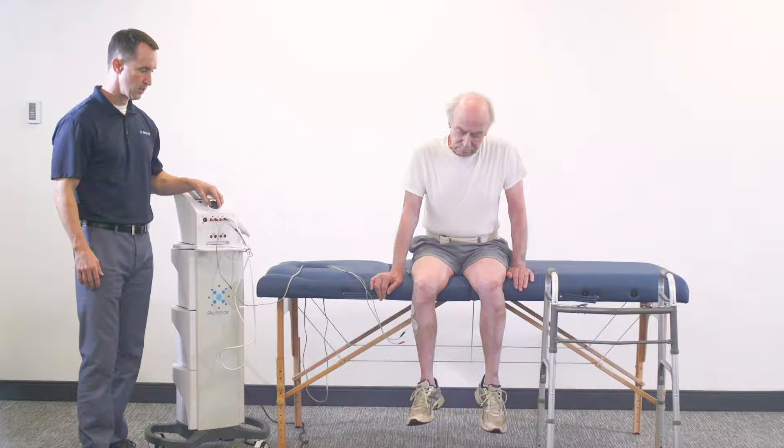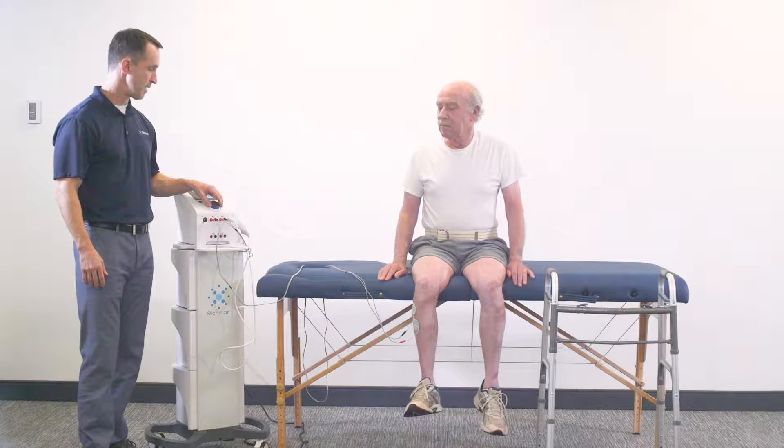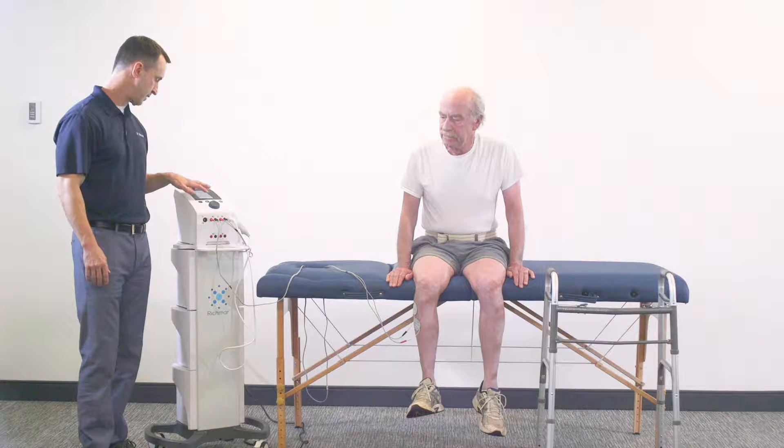Now we're getting a really good contraction. We've got a cycle time of continuous. I'm checking with the patient — is that tolerable? I'm going to back it down just a hair, and then we're going to go ahead and start.